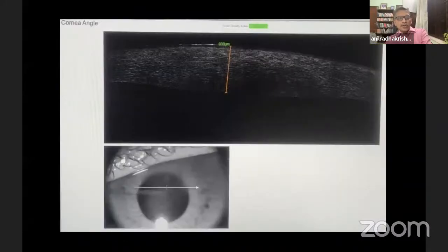So actually, this patient has got an upper part. She had an adenoviral keratoconjunctivitis with a large amount of stromal edema in the upper part, immune mediated. So that is what is shown here. That is why the value came to the plus side.